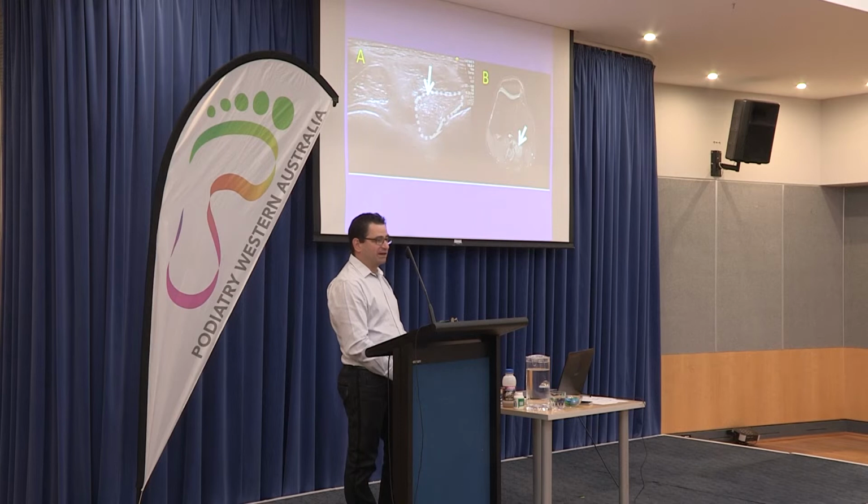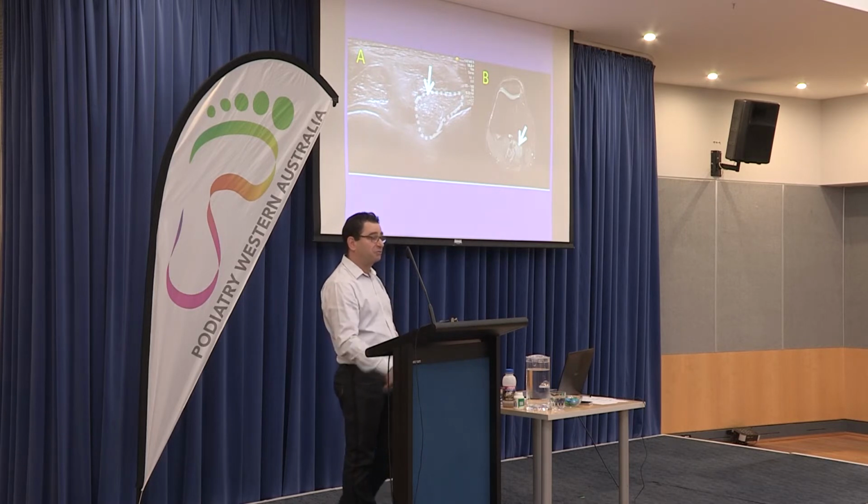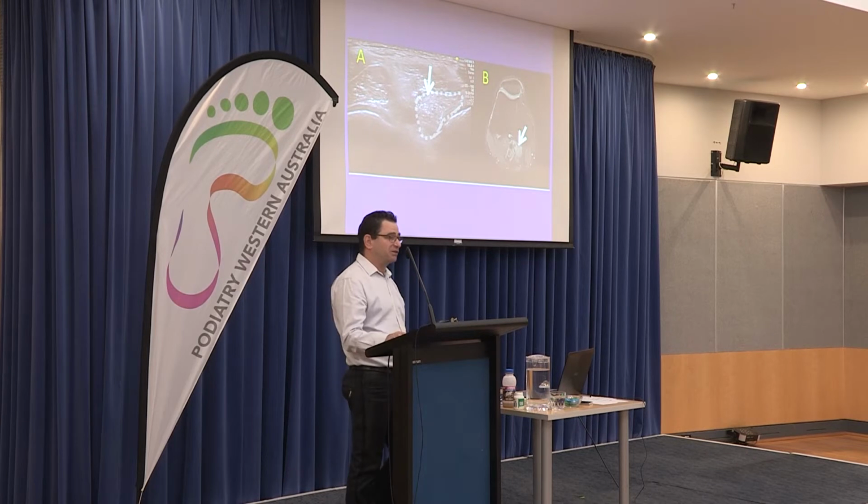So totally, if you're listening at the tib post at the ankle or the dorsalis pedis or something like that, and you get them to exercise and do a little bit of foot flexion, things like that, and you notice that the signal goes away, that would be supportive. They might still have it and you might not be able to detect that, to tell you the truth, but yeah, it's certainly something to think about.